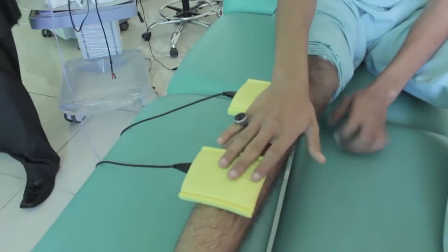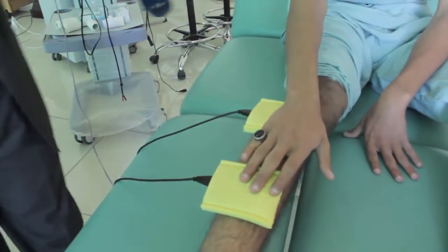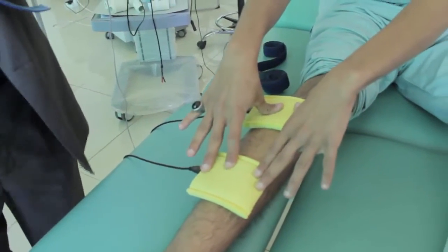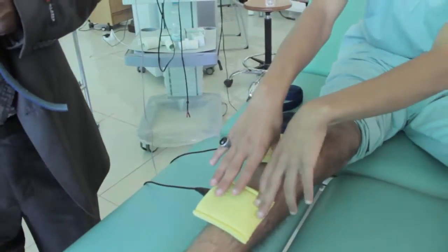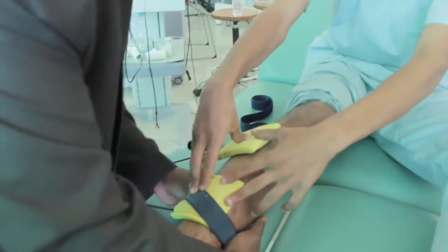No, I am stimulating, currently I am stimulating dorsiflexors. The important dorsiflexors are tibialis anterior, extensor hallucis longus, extensor digitorum longus. Okay, these are some of the important dorsiflexors and lateral group muscles.